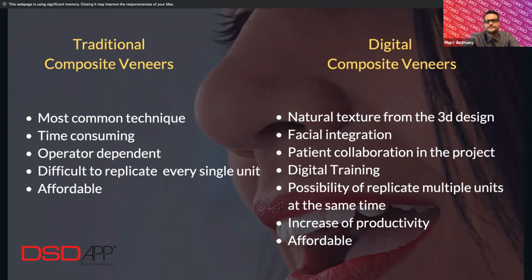So let's go to the digital composite veneers. In the digital composite veneers, you have the natural texture from the 3D design, which means that the buccal surface, which is the hardest part when you are creating composite veneers in the patient's mouth, becomes the easiest part.